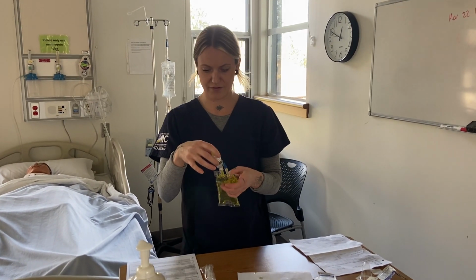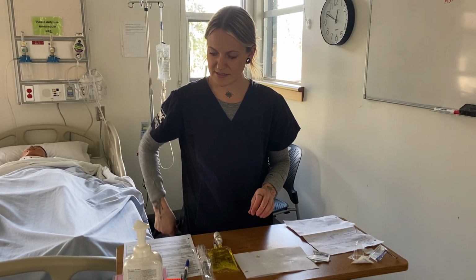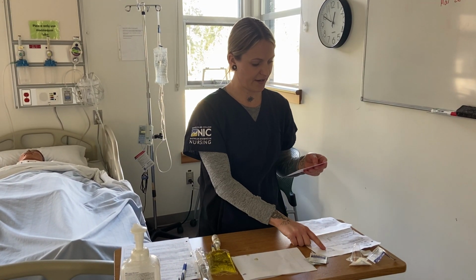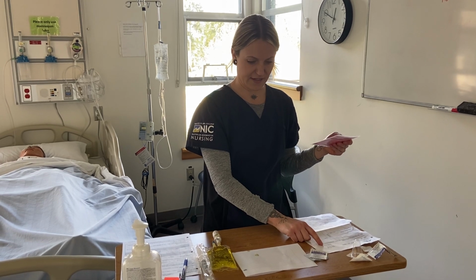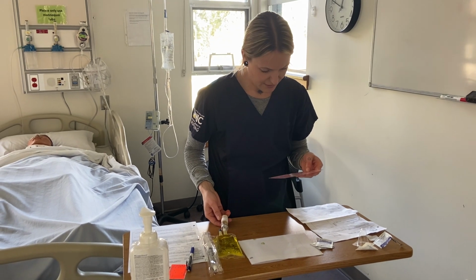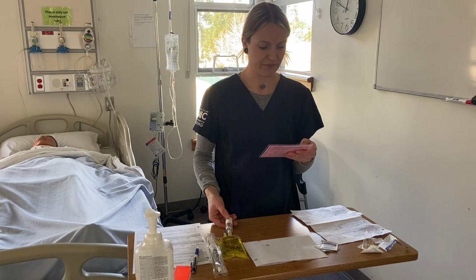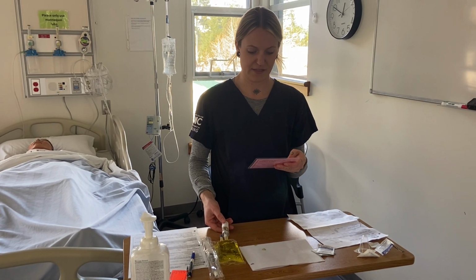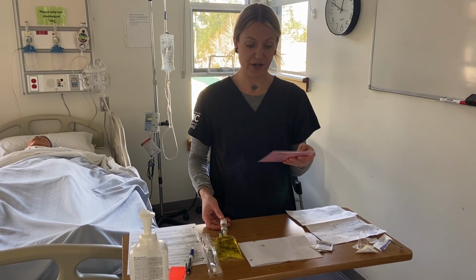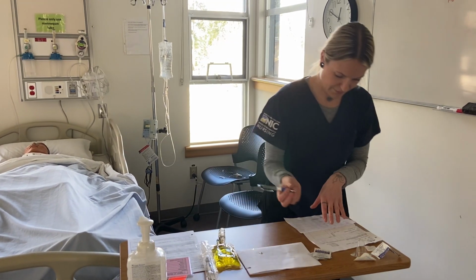So before I remove that, I will move on to my 7 rights. So I have the right patient, which is Jen Eric, the right drug, cefazolin, double check that, cefazolin, right dose, 1 gram and 1 gram, right route, IV, right time, it is 8 o'clock, which is right about now, right reason, she's got an infection, it's an antibiotic, and right documentation. I will dot my MAR.